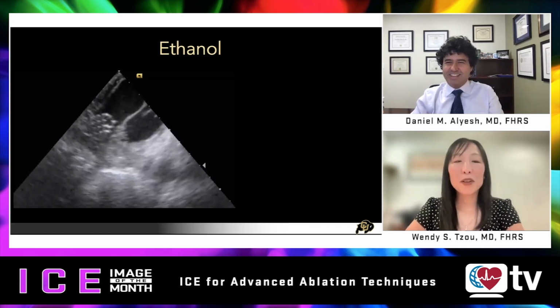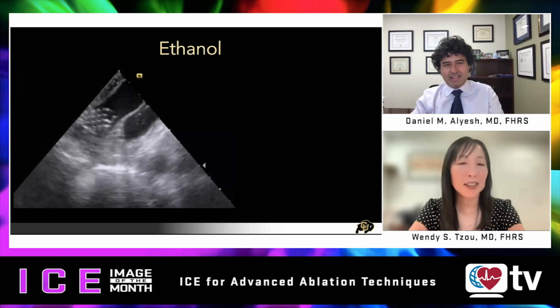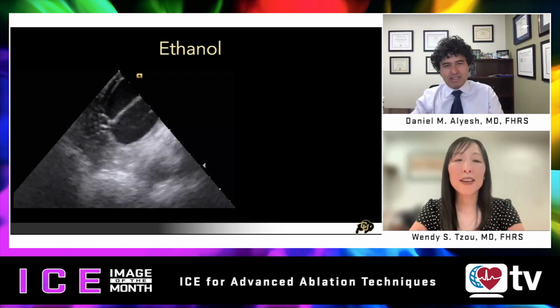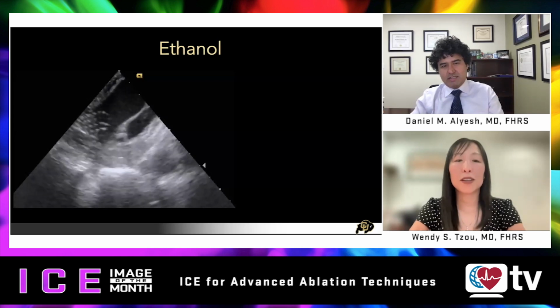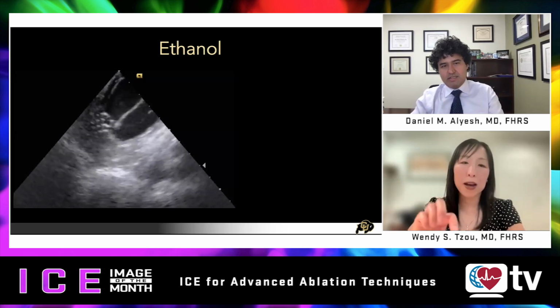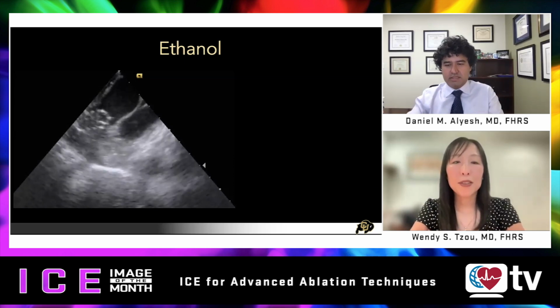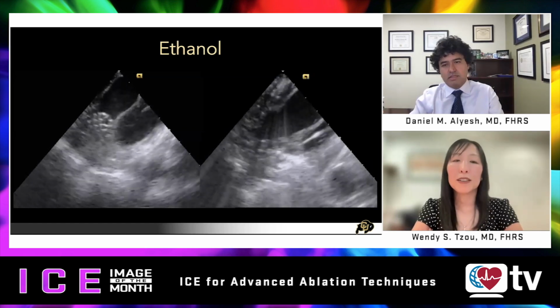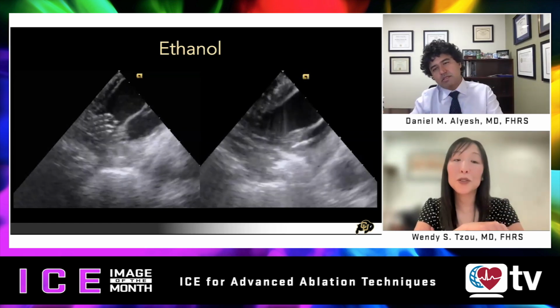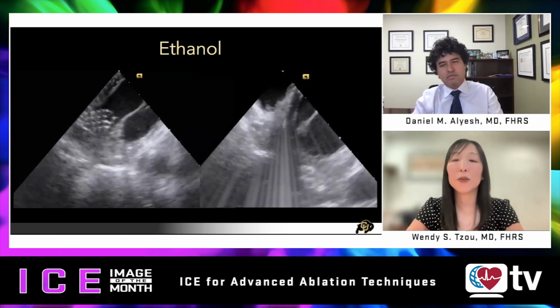And you can see here, what I wanted to really show with this left-sided image was that we had done extensive multipolar mapping. This is how this region of interest, which is in that area by the AMC, looked at baseline. And then in the subsequent image, we've done standard unipolar ablation using half normal saline in this area, and still we're getting the PVC frequently.